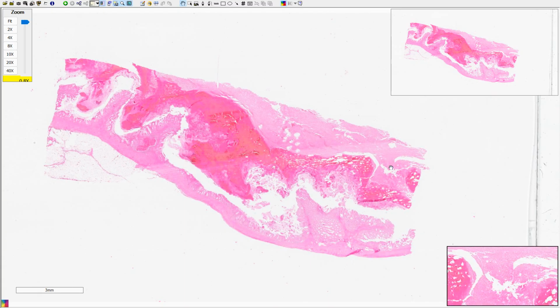This is actually the exudates of the coccidiosis inflammation in the cecum. We call it typhlitis. This kind of typhlitis also produces inflammatory exudates. This one is the inflammatory exudates, and this one is the intestine or the cecum itself.